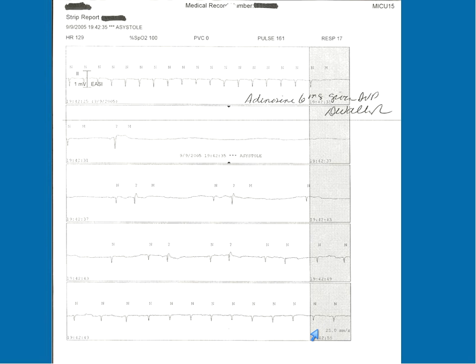See if I can tell you how long this is. I gave it at 31 seconds, 6 seconds, another 6 seconds. Each of these represents 6 seconds. So it took about 12 seconds for something meaningful to come back, and about 18 seconds before I had a good rhythm established. The heart rate always comes back. That's the good news. But you still hold your breath.